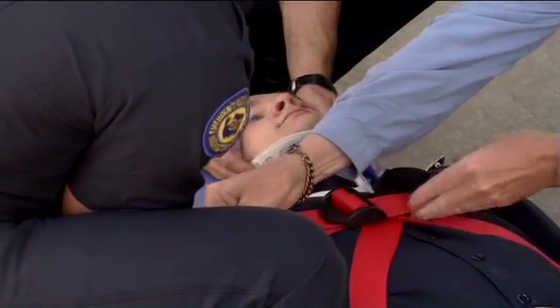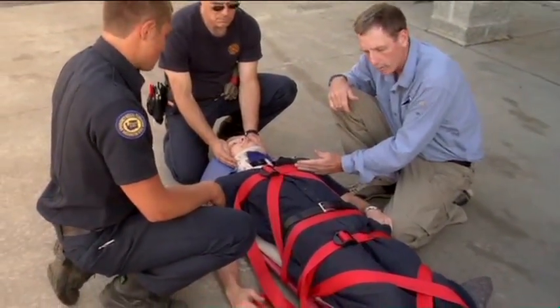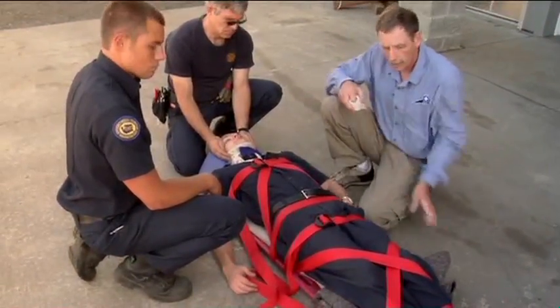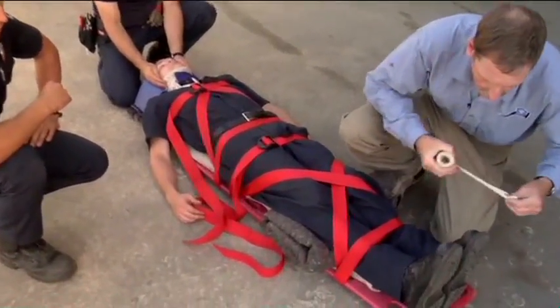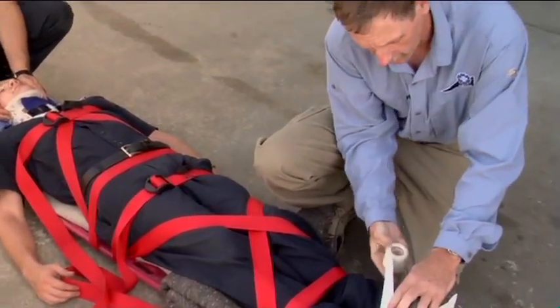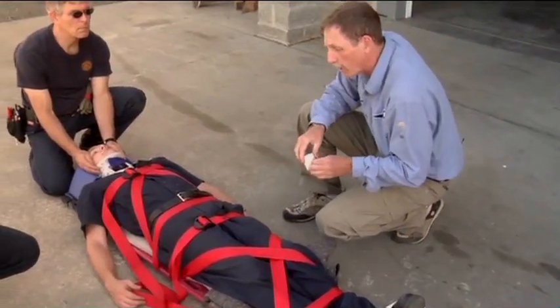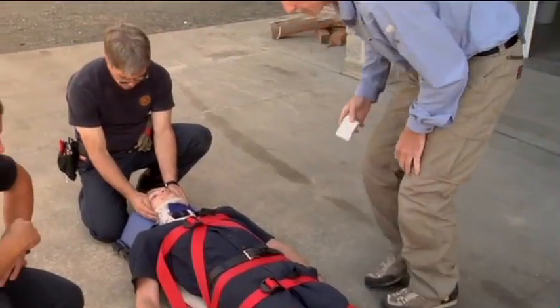Deep breath. So now we have 1, 2, 3, 4 lateral straps and 2 sets of cross X's here to hold the patient in place. Now if we really want to make sure that this patient stays put, we can add some tape around the feet if injuries allow. By the way, the nice part about these straps is that they will adjust very well to accommodate different injuries on the patient by simply rearranging how you do the straps.